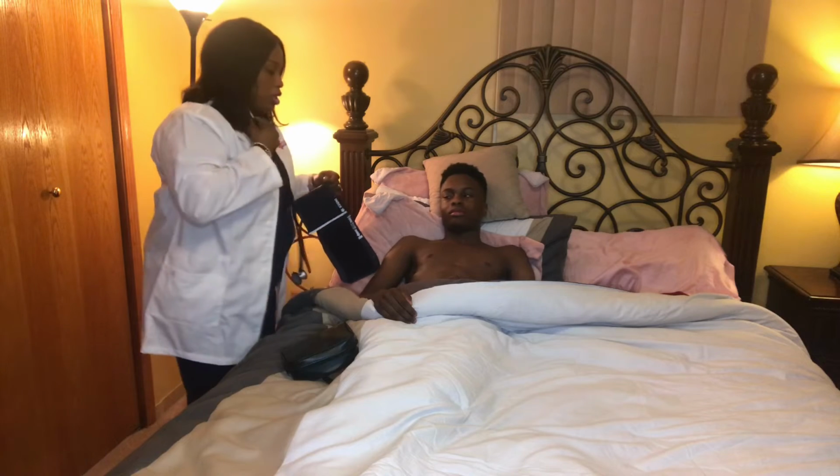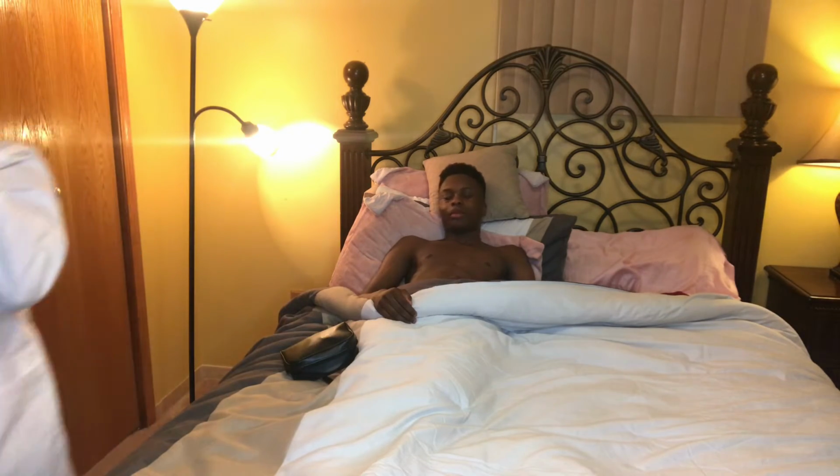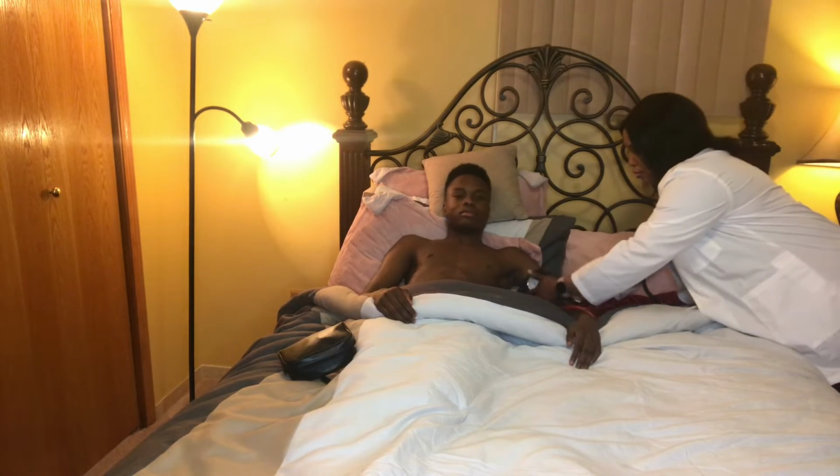I'm going to go on the other side also to do your blood pressure, okay? So I'm doing your left arm blood pressure.